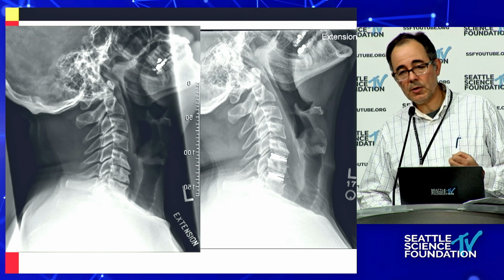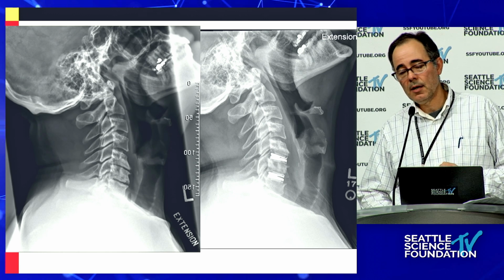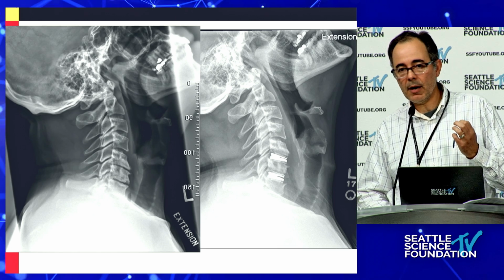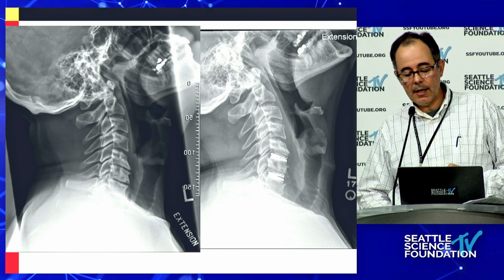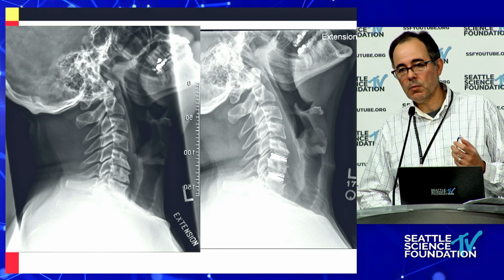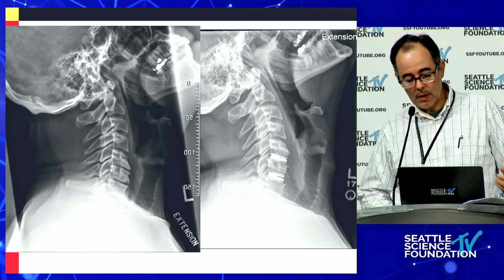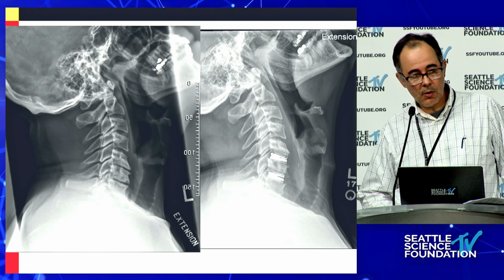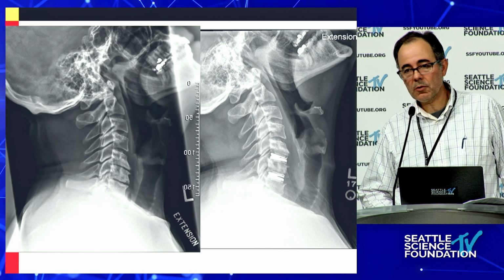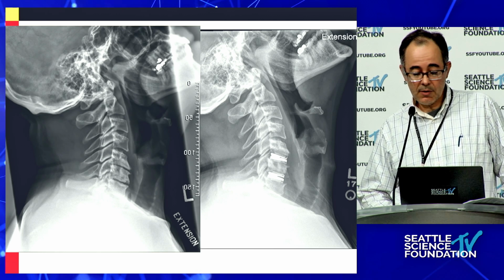I think the original distraction from the arthroplasty was lost with a slight amount of subsidence. And that slight loss of the distraction resulted in redevelopment of the foraminal stenosis. After foraminotomies, he's back to square one and is quite happy and has maintenance of his motion.